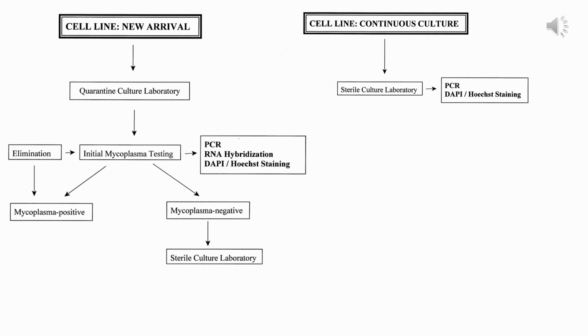One has to always remember that once every few months, maybe once or twice every year, one has to check whether there is any Mycoplasma contamination or not. Of course, as I have told you, if your results are changing or not reproducible, then that itself is an indication. But whether there is any indication or not, one has to check every year, twice a year, whether there is any Mycoplasma contamination.